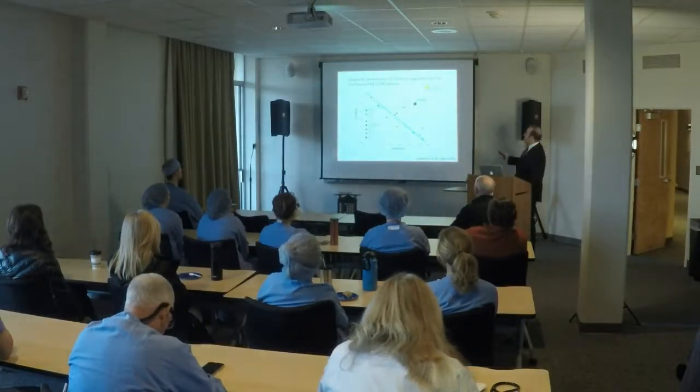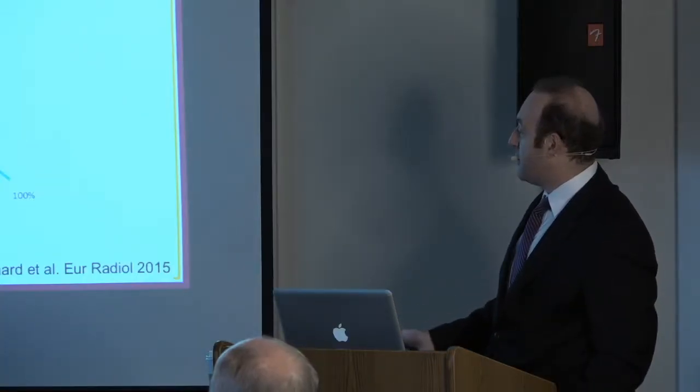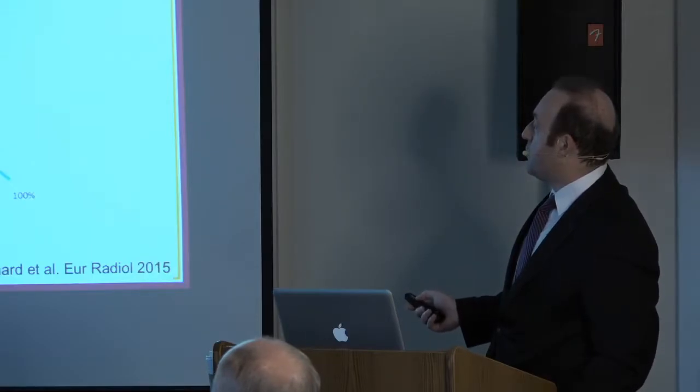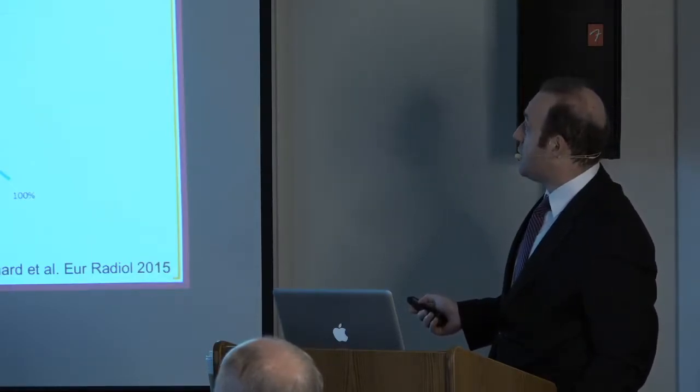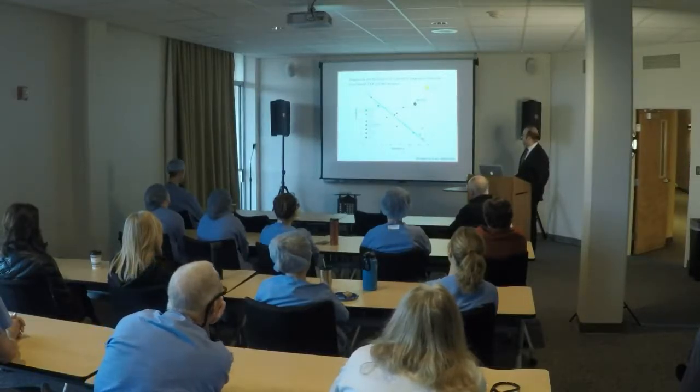Now, when looking at the diagnostic performance of coronary diagnostic tests compared to invasive FFR as a reference standard, where you want to lie on this slide is in the top right. You want a test that has high specificity and a test that has high sensitivity. Okay, and you can see that with the most recent NXT trial published in Journal of American College of Cardiology, FFRCT had higher sensitivity and specificity compared to other non-invasive tests.